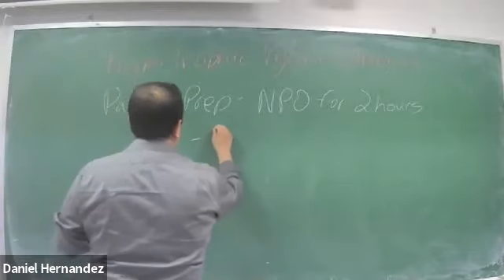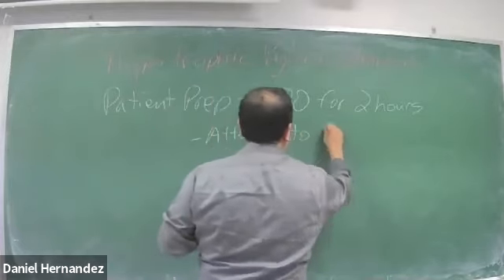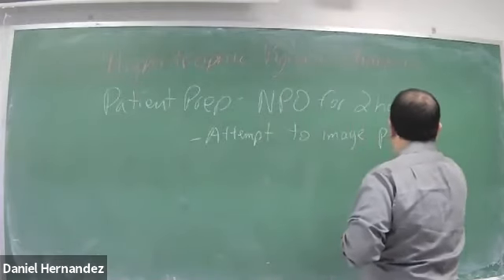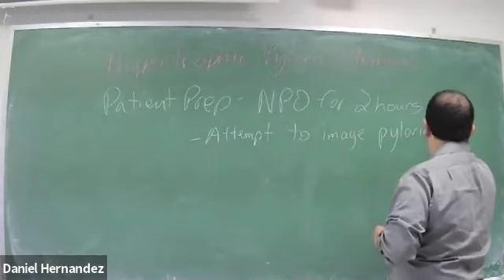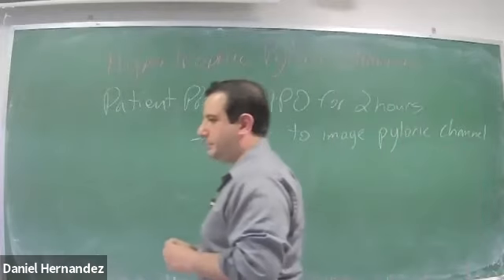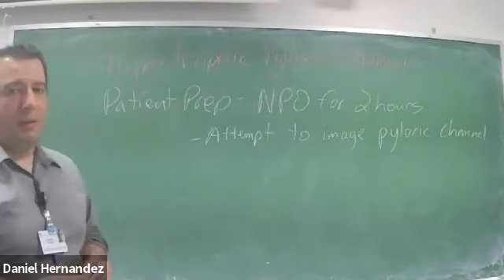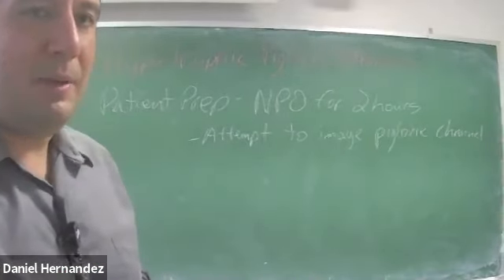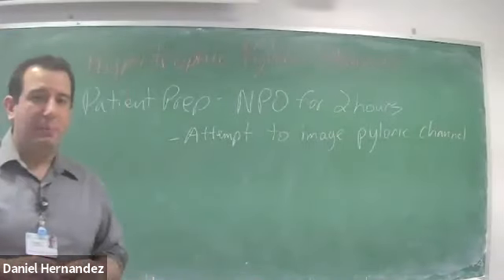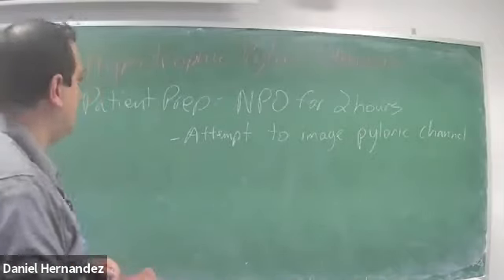We will then attempt to image the pyloric channel. And the good thing with this exam is that if it's positive, it's much easier to see, like the appendix studies that we do. A positive pyloric study is definitely noticeable.